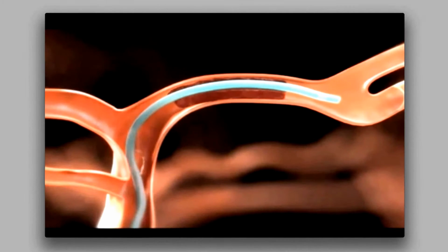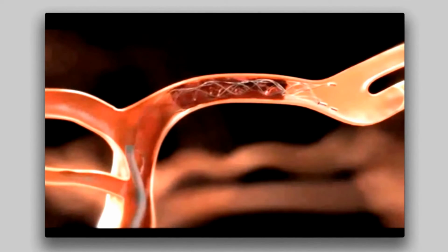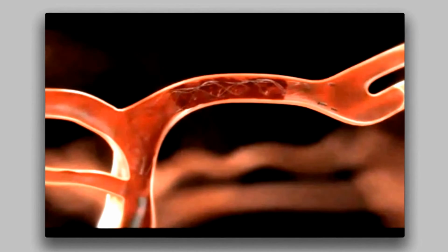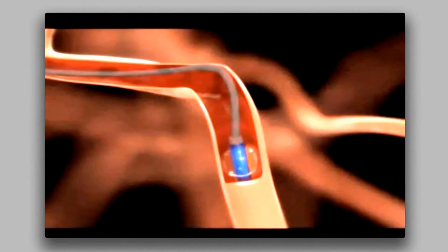With the treatment device across the clot, the catheter is withdrawn, exposing the retrievable stent and allowing it to enmesh the clot. More proximally in the arterial system, a guide catheter is used to inflate a balloon that blocks flow temporarily, and then the device is slowly withdrawn, pulling the clot out in the retrievable stent.